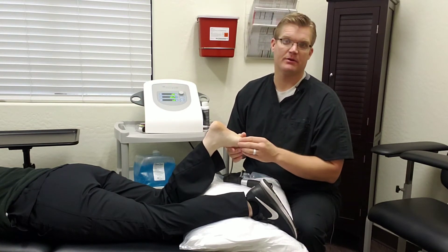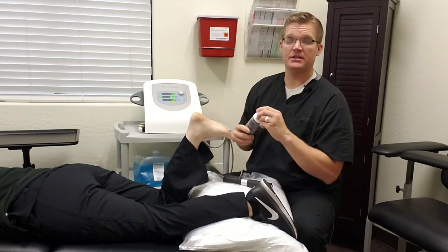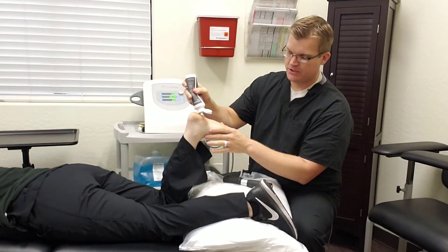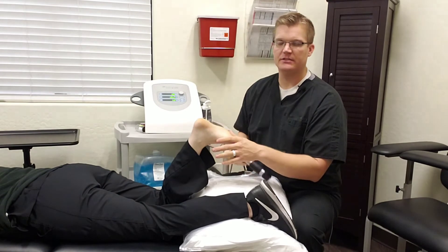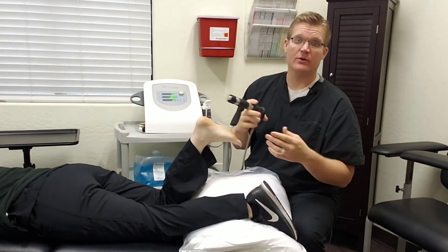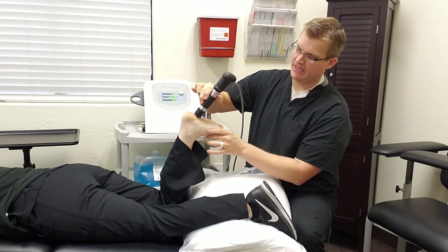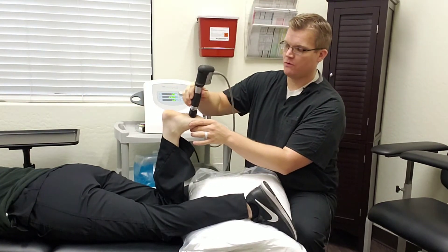If that knee pain has since resolved but returned with new activity, that can be successfully treated with radial pressure wave therapy as well. We're going to give a quick demonstration of what it sounds like and what it feels like. We just apply a little bit of ultrasound gel to the area — it does make a loud noise and there is some discomfort because we're breaking up scar tissue. We'll work this whole fascial bundle.